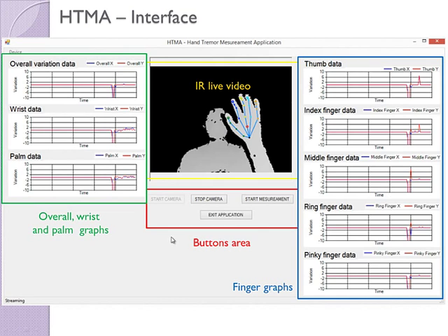On the left side, line graphs show the wrist and palm variation along with an overall measurement that averages the data from all the micro variations.